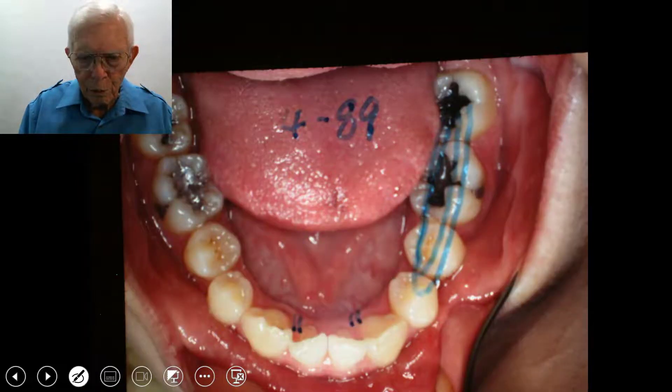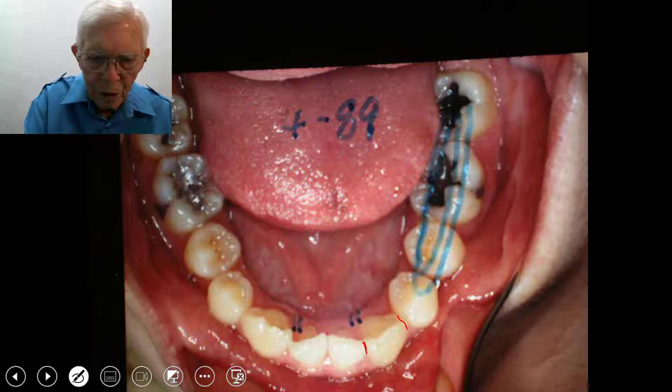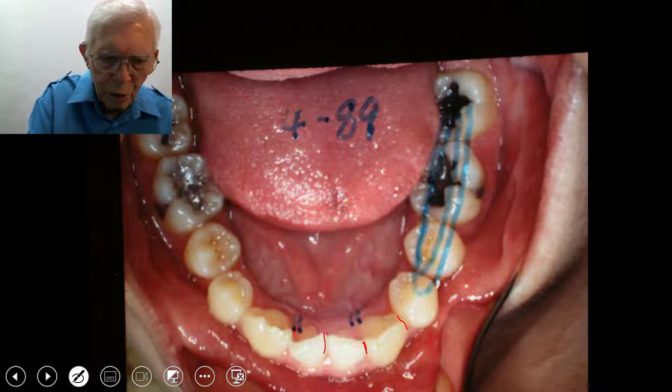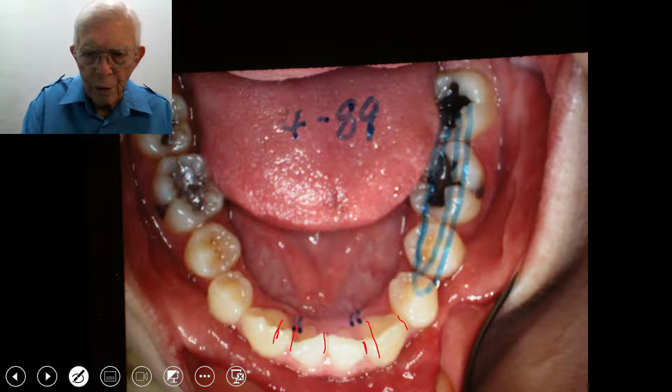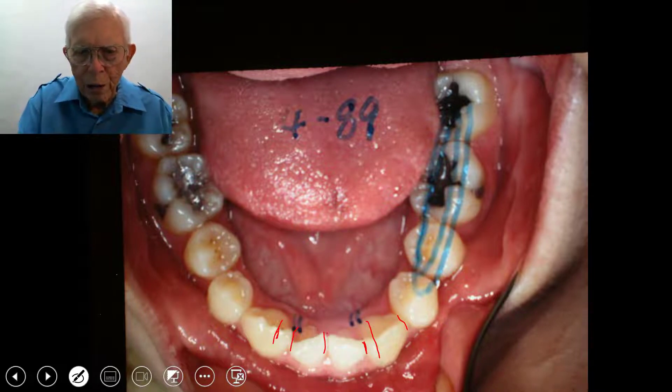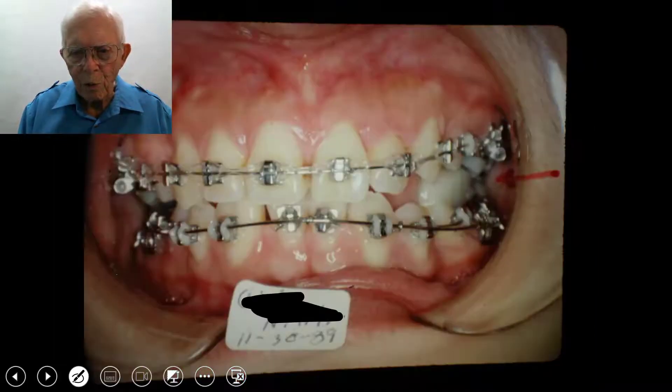When you look on the bottom, the cuspids are very wide, and these central teeth right here are narrow. The lateral is fused in with this cuspid tooth in this area. We put a block in here to open the bite. There are different ways you come up with to use those and how to strip them if necessary to make it work out.